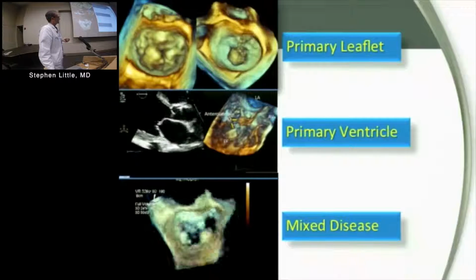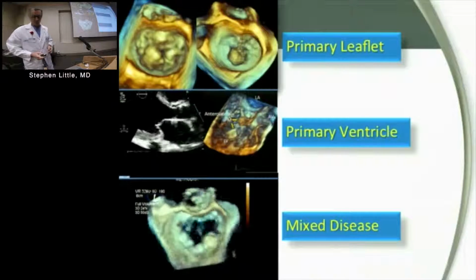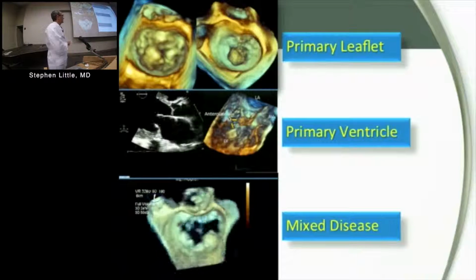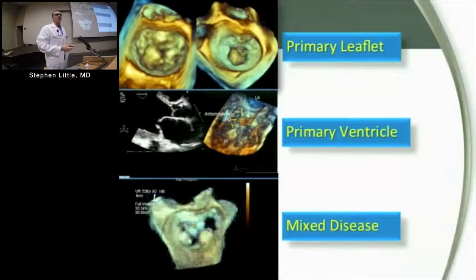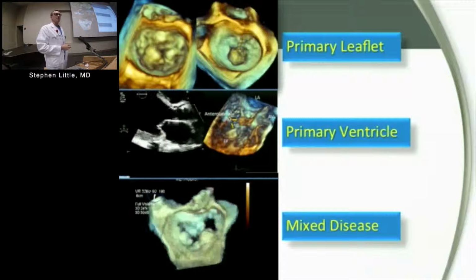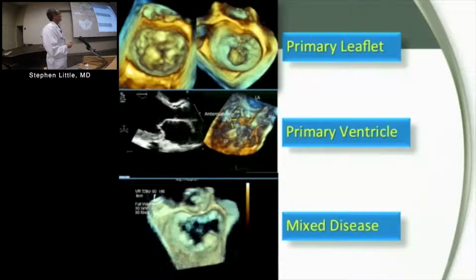So emphasizing at the beginning really the concept of the reports, and it's amazing in the valve clinic we get these echoes from all over the place, and more often than not they have no mention of the etiology of the MR. There's a severe MR, sent for intervention, and nobody's actually bothered in the reports to say what kind of MR. Is it primary leaflet?